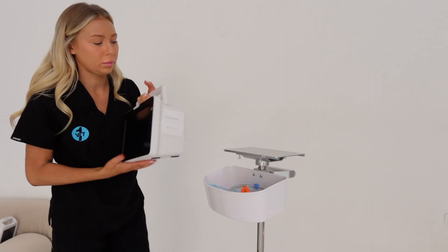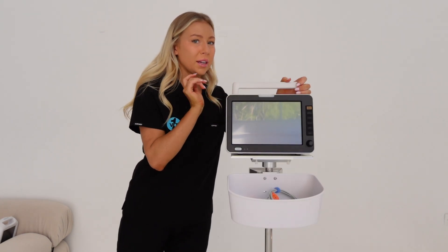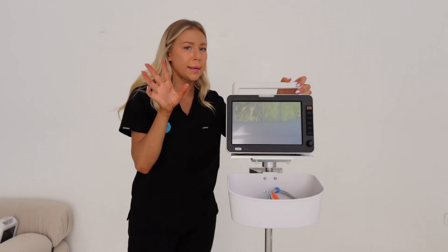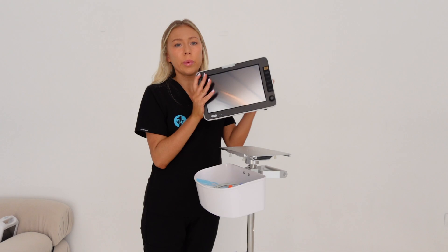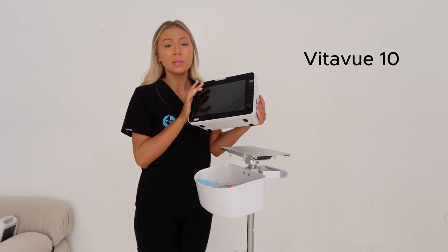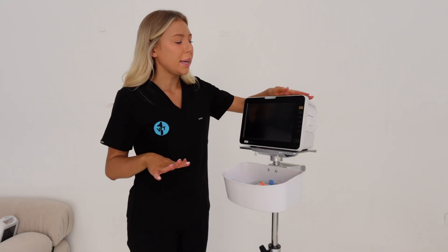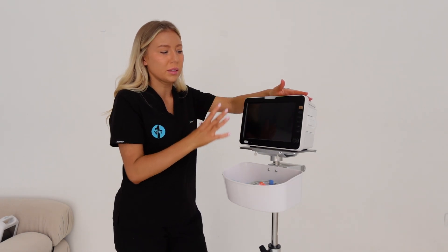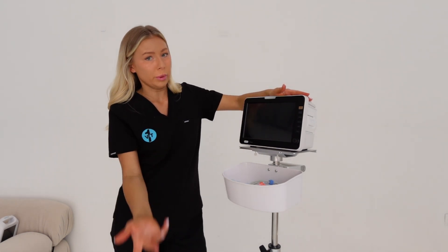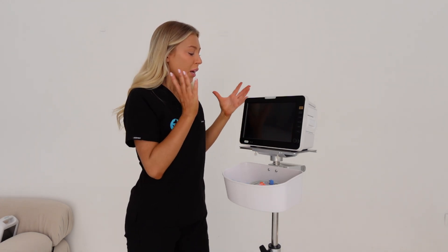The next monitor is called the VitaView 10 - the 10 means it's 10 inches. I've also got a 15-inch over here that I'm going to show you, which I am obsessed with. The VitaView 10 is definitely the most popular one we've got. It gives you a little bit more screen space and you're able to change the layout of where your parameters sit, depending on your clinic preference.